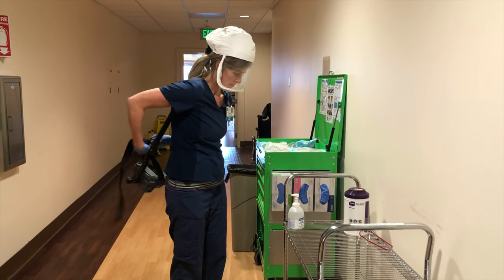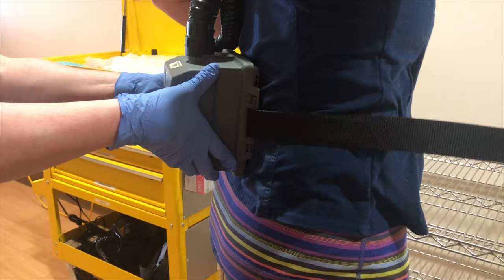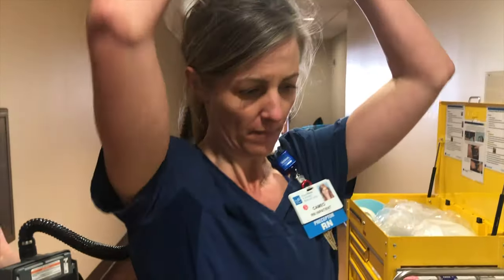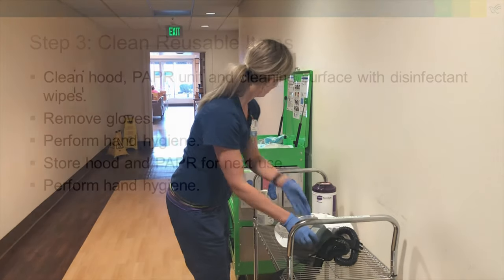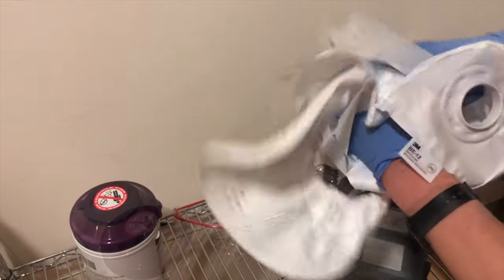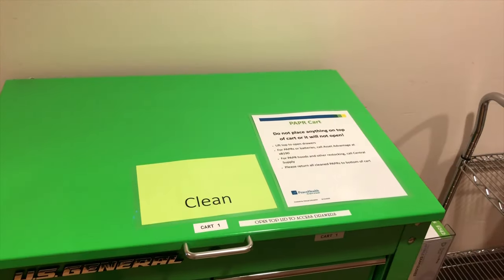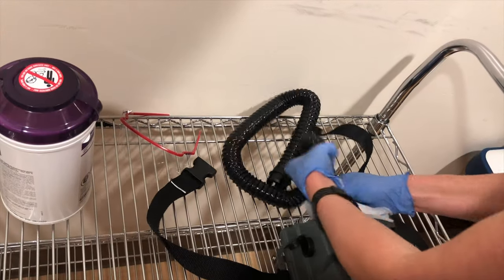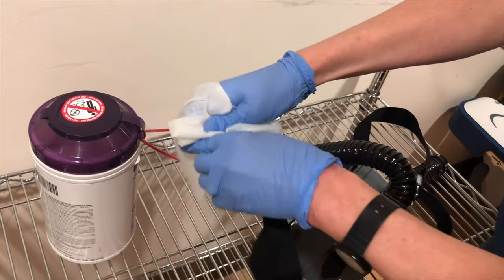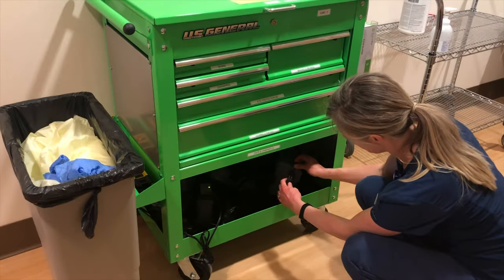Unbuckle the PAPR unit at the waist, holding it away from your body. If you have an assistant, have them hold the PAPR unit with gloved hands while you unbuckle. Grasp the hood at the edges of the shield and pull it up and away from your face. Be careful to only grasp the edges of the shield and not contaminate the inside of the hood. Thoroughly clean the outside of the hood with disinfectant wipes. If you feel the inside of the hood became contaminated while doffing, clean the inside as well. Place it on a clean surface. With a separate wipe, clean the outside of the PAPR unit, focusing on the high-touch areas including the hose and the buckles. Follow up by wiping down the surface you're cleaning the unit on. Remove your gloves and immediately perform hand hygiene.